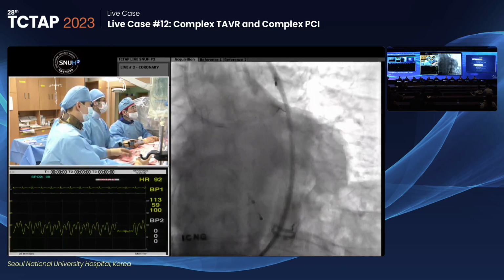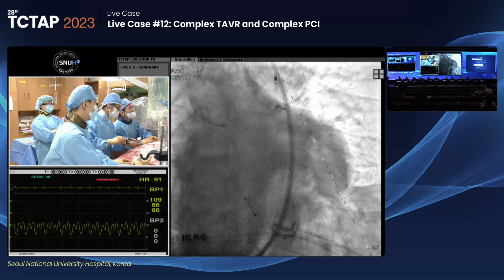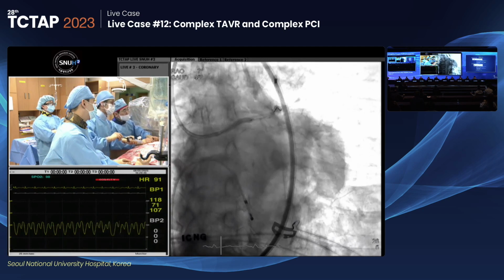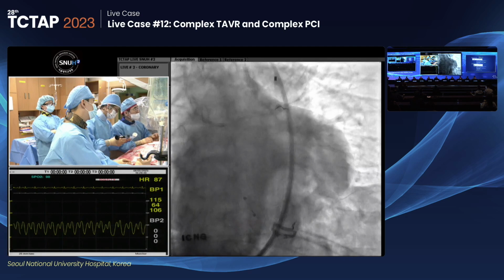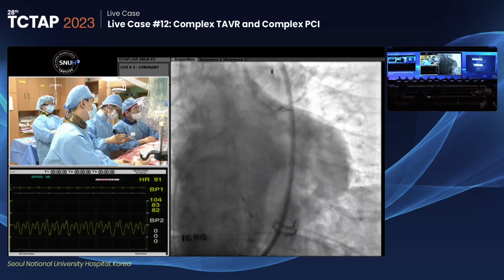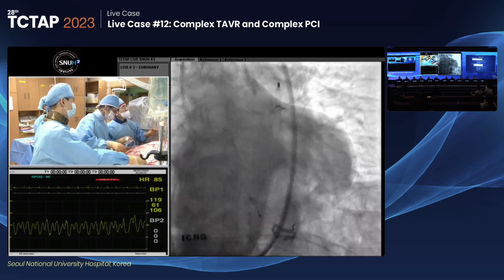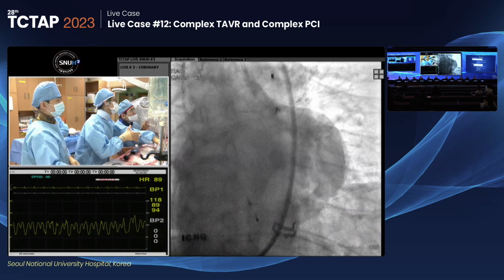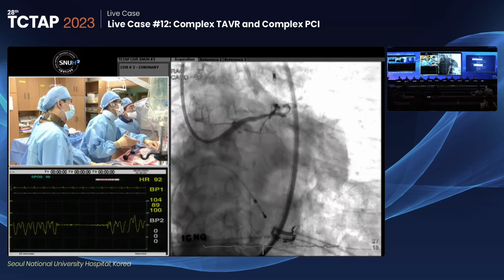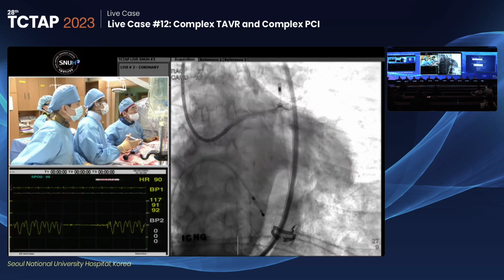Is the right coronary artery open? Yes. Not perfect, but the middle part of the right coronary also has a lesion that cannot be stented because it's corkscrew calcification. It's kind of open. Yeah, it's better than it was last week. But it's very tortuous too. Yeah, it's not stentable. Okay, flow is much better. Cranial, and much better. And AP cranial, take a look at that.